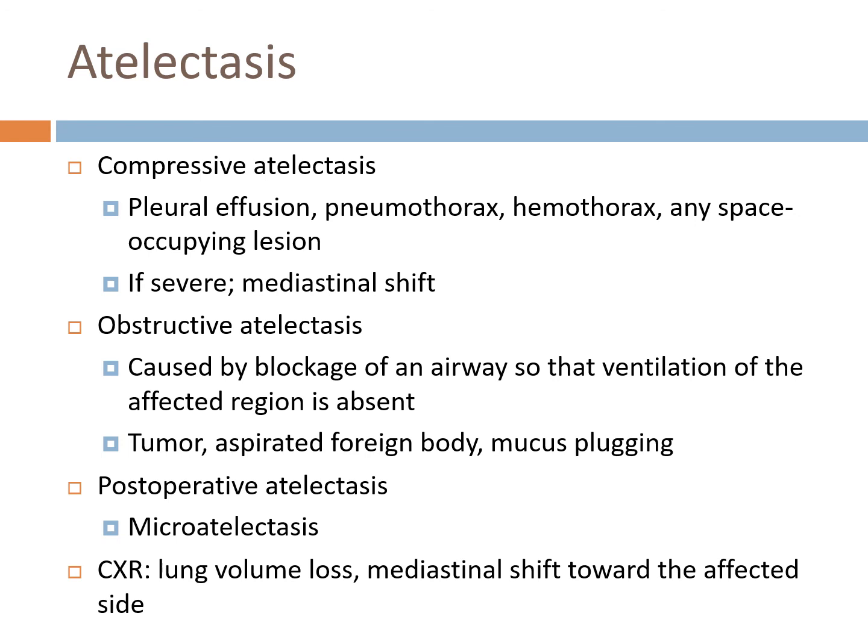So we're talking about entire segments or lobes that have collapsed. The shift of the trachea and heart and major thoracic vessels towards the affected side may be seen with lobar atelectasis, where a whole lobe has become atelectatic. So I guess scratch my other statement that I said.